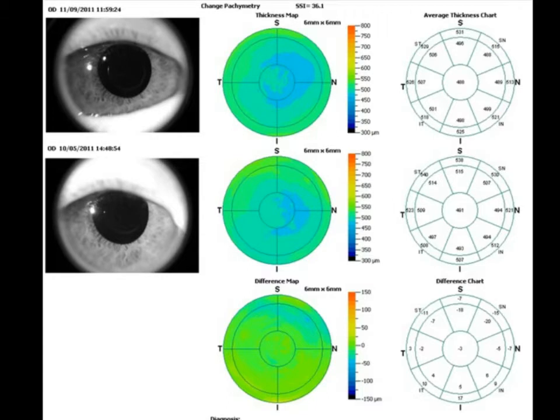Well, the OCT, the anterior segment scans, and the pachymetry scans in particular are almost user-error proof, in that it doesn't matter how you're actually measuring them, because you're looking at the cornea and the OCT is just simply giving you the scan or giving you the view. So it's not dependent on how perpendicular the probe is to the surface of the cornea. So what you see here, if you divide this printout into three, you look at the very top row horizontally, the middle row, and the bottom row. The very middle row is the first visit of this patient.